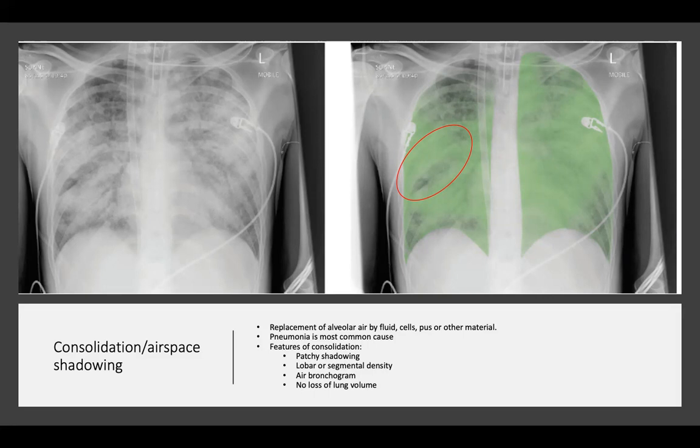There is no loss of lung volume in consolidation. Lung volumes may actually increase in the early stages, and in later stages there can be small loss due to secretions obstructing the airways, but as a general rule there is no significant loss. In the x-rays shown, there is consolidation in both lungs with moderate sparing of the apical segment of the right upper lobe, with patchy airspace shadowing marked in green and an air bronchogram visible inside the red circle.